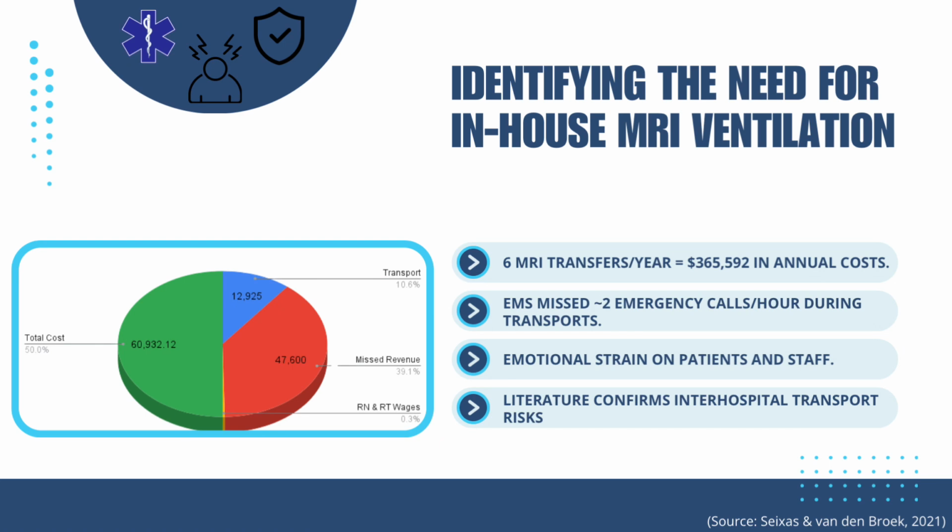On top of this, there was the emotional strain on the patients, the delay in the MRI imaging, and known risks of interhospital transfers, like potential tube dislodgement, barotrauma, all of these things. So it made it pretty clear that we needed an in-house solution.